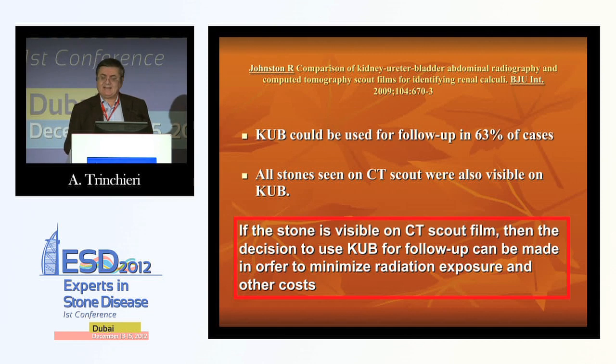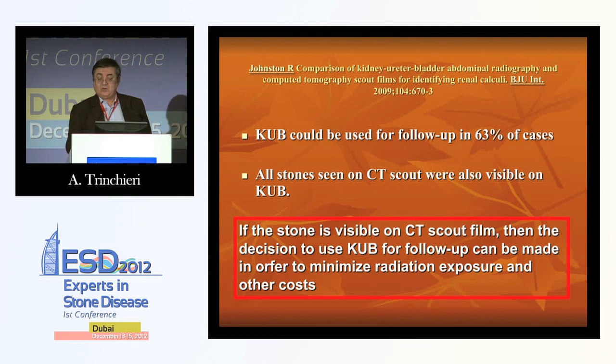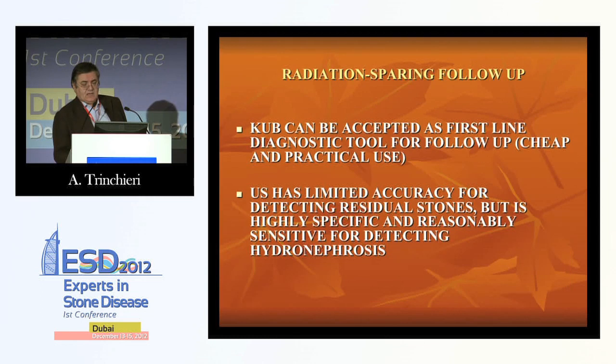we must use alternative imaging methods for follow-up, and this study demonstrated that when the stone can be seen at the CT scout, it is also visible in plain X-ray. So this happened in about 60% of the cases. And in these cases that are a relevant number, you can plan your follow-up with plain X-ray only. So plain X-ray can be accepted as a first-line diagnostic tool for follow-up.